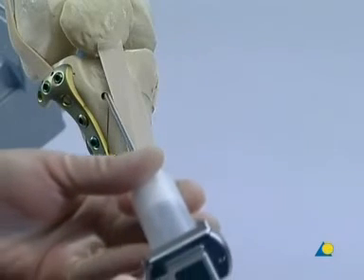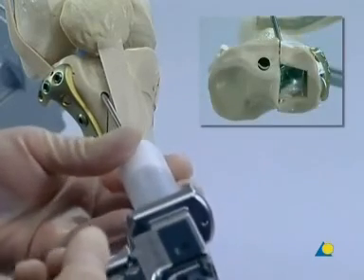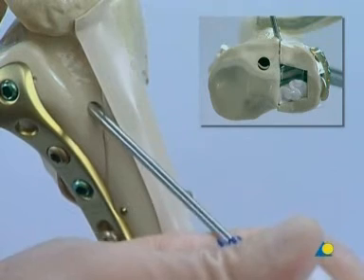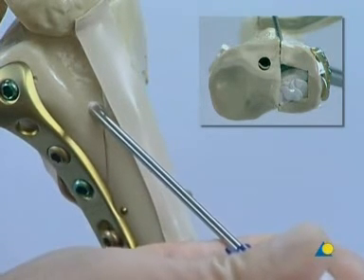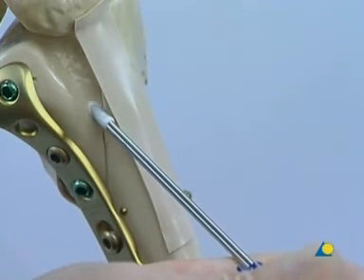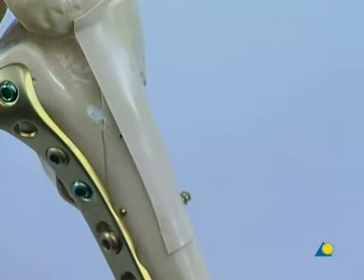The cannula is inserted into the defect and the defect is filled by squeezing the trigger slowly and steadily; excessive pressure is avoided. Finally, excess Kronos inject material is removed from the bone surface.